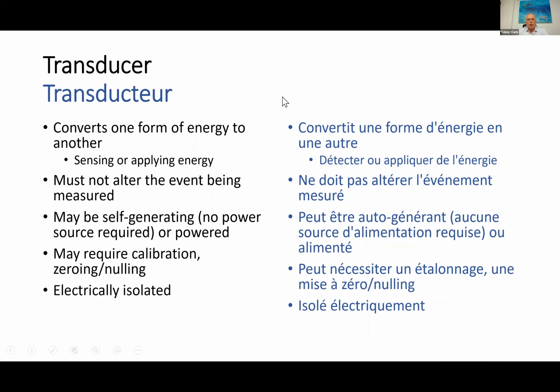A very important part of the physiological monitor is a transducer. This is a type of sensor, and most sensors follow this pattern: they convert one form of energy to another. And typically a mechanical, optical, electrical, or electrochemical signal from the body gets transduced into electricity to send a signal to the physiological monitor.